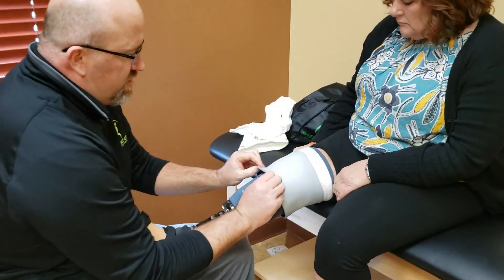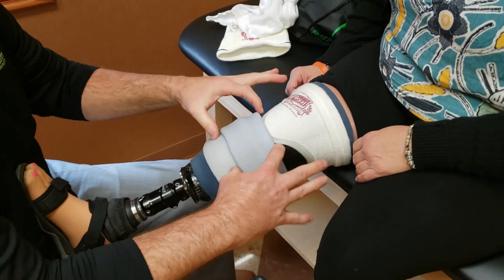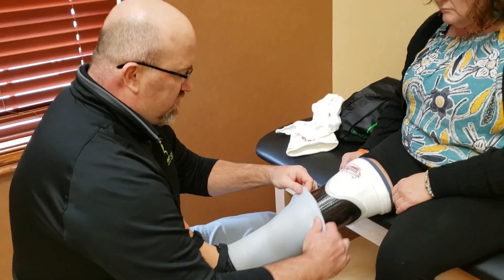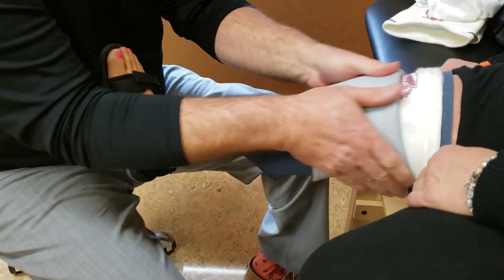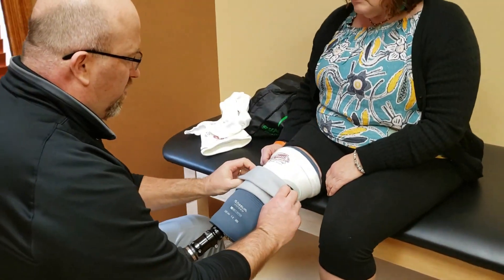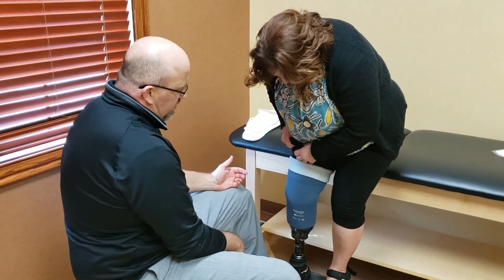One thing I recommend: pull the sleeve down to within about an inch of the trim line of the prosthesis, then reflect it one more time — a double flip. What that does is keep the bulk of the suspension sleeve right around the top of the brim of the prosthesis. If instead you fold it way up high, the whole sleeve starts to work its way down the frame of the prosthesis, and with certain limb lengths it ends up at the bottom, so you lose the ability to have a good seal at the top. The double rollover method prevents the sleeve from sliding down.